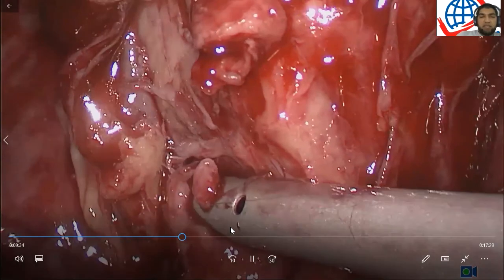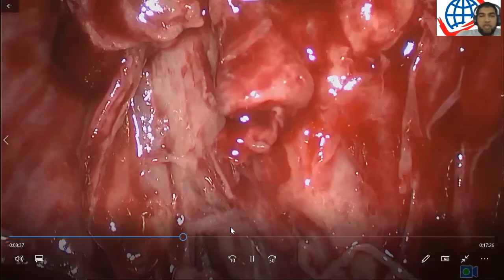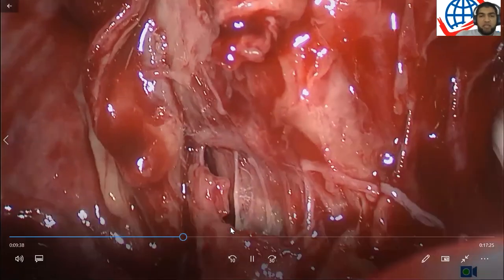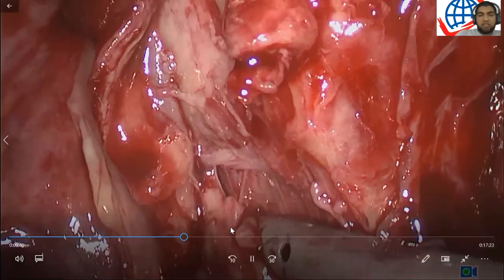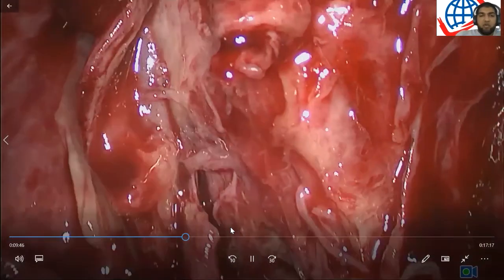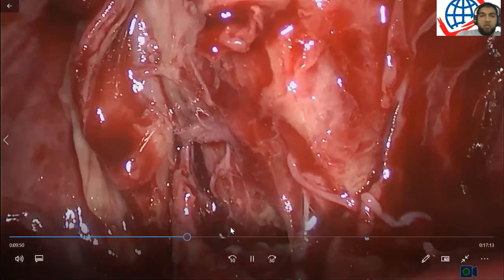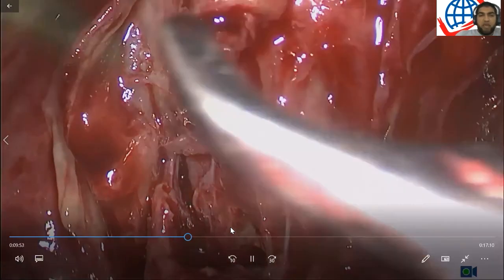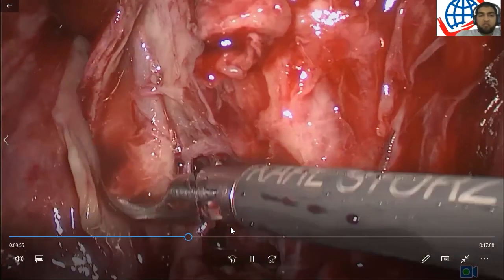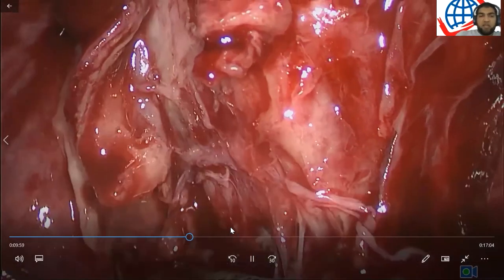In a case like this, it's very difficult. The normal textbook demonstration, and as we've shown you pictorially in the initial slides of the nice cystic duct and cystic artery going into the gallbladder, is actually a luxury. In a lot of the cases that we do, we find that the gallbladders are so bad that identifying those two structures easily, and we'll show it in this case as well, is very, very difficult.